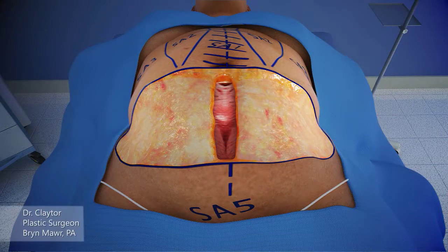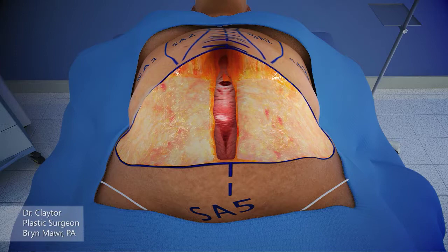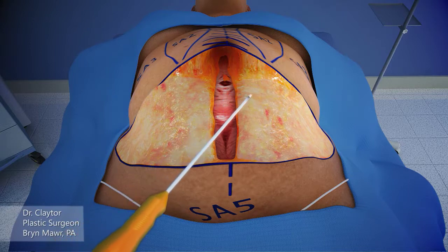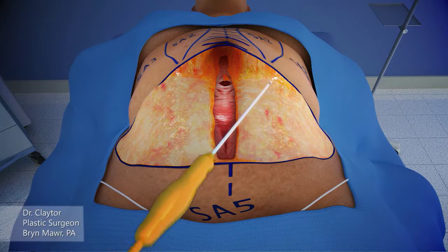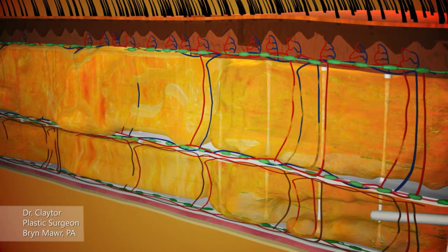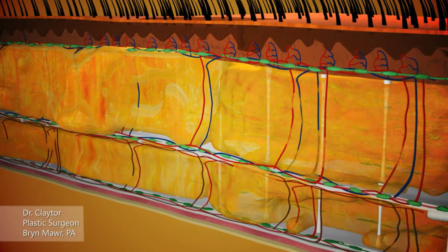Scarpa's fascia is maintained laterally. Centrally, the dissection is carried down to the rectus fascia. The tunnel is carried up to the xiphoid, and discontinuous undermining is performed with liposuctioning underneath suction area 2 and suction area 3. This liposuctioning can be done either deep to Scarpa's fascia or superficial to Scarpa's fascia — here it is being done deep to Scarpa's fascia.